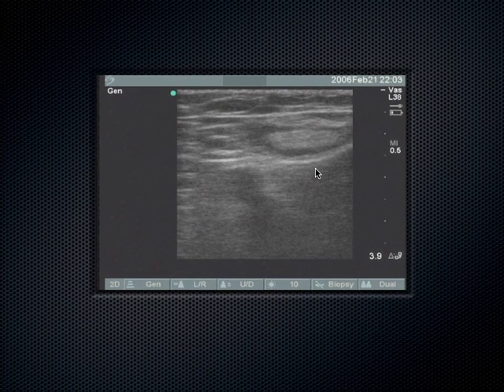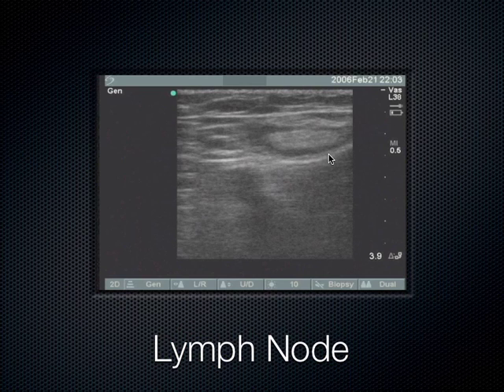This is a very enlarged lymph node, and we see that in cases of infection. So there's an infection downstream, down the leg, maybe around the lower extremity, somewhere around the calf or something. The skin's kind of red, the leg is kind of swollen, and then you don't see DVT, but you see a really enlarged lymph node. It helps sway you clinically towards cellulitis or infection and away from DVT. That's an inguinal lymph node. Correct. Inguinal lymph node. That's enlarged.